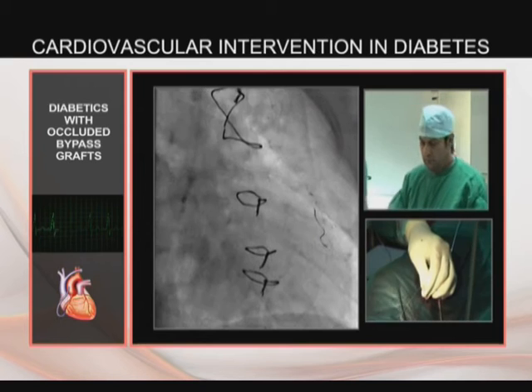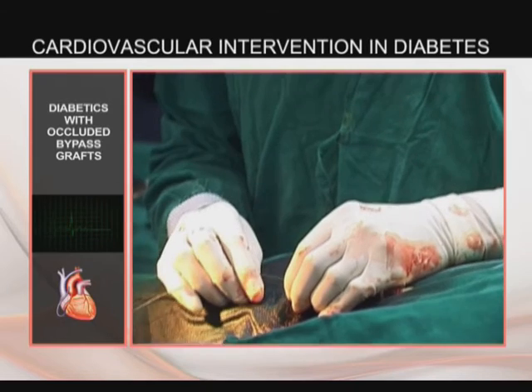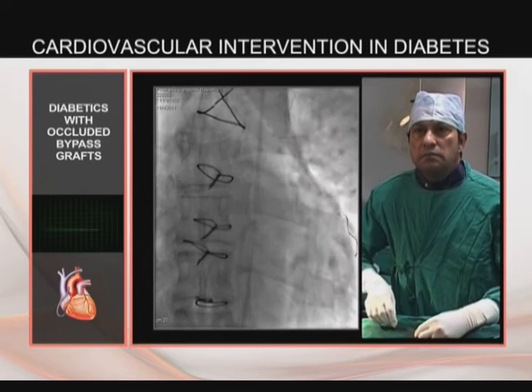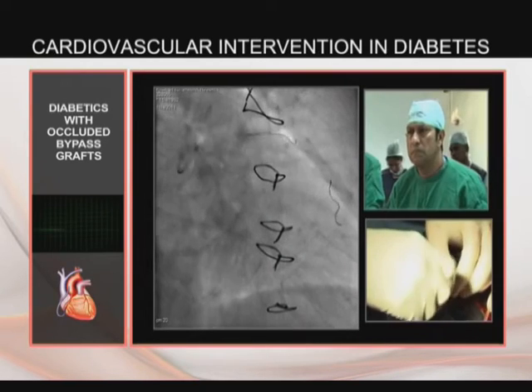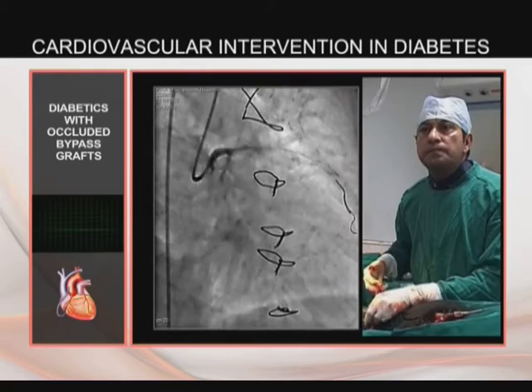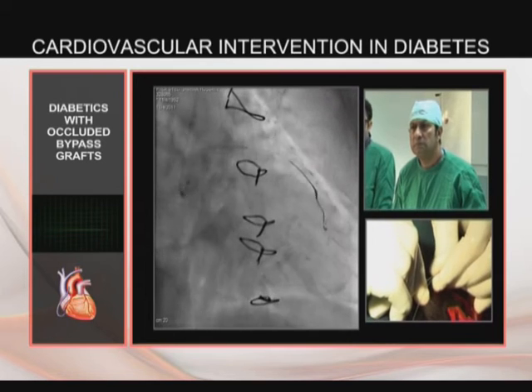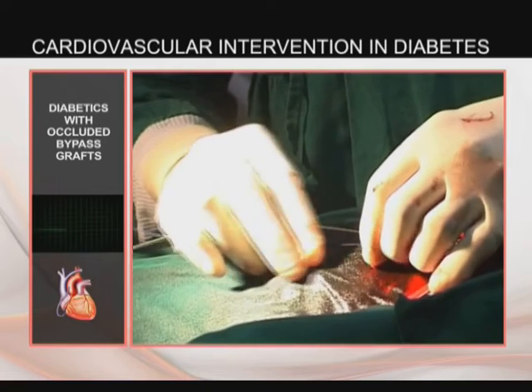Post balloon dilatation. This is a 2.75 by 28 BioMime drug eluting stent which is being advanced, but it is difficult to advance on the BMW wire. This is due to lack of guiding support and also because the lesion was very calcified. So a second buddy wire is being used. This is also a BMW wire which is placed distally, and a balloon dilatation is done at high pressures, and then you can see the BioMime easily passing through this particular tortuous bend into the calcified lesion and well placed at the site of the stenosis.